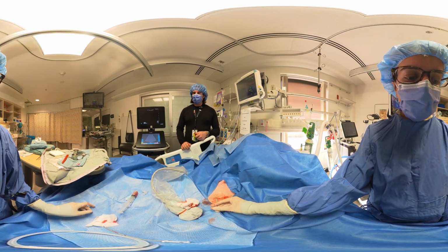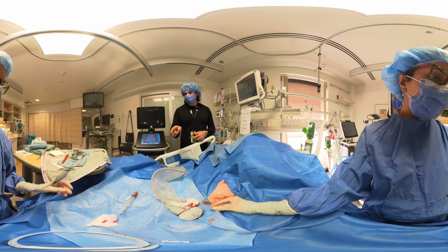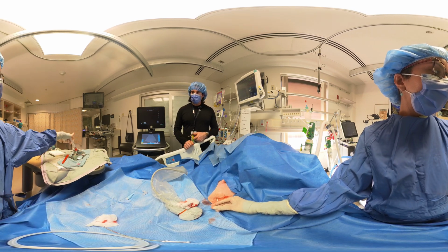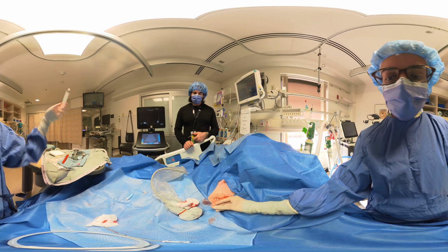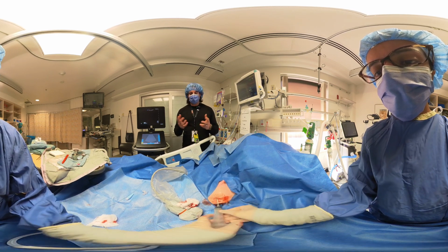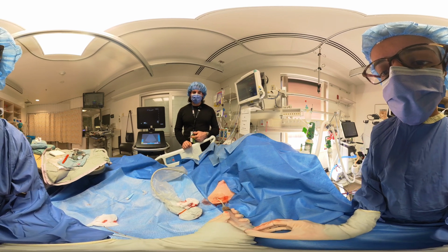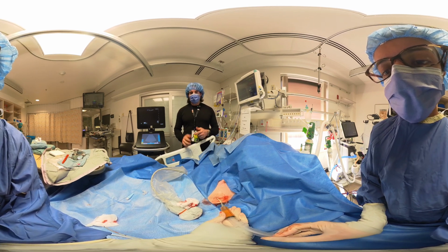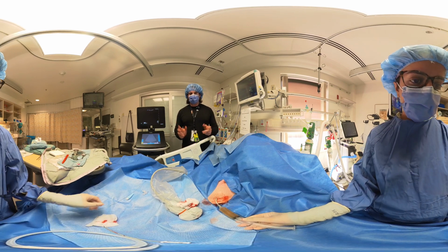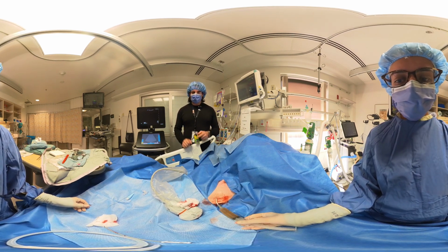Okay, and at this point, we can get a sample. So let's actually, I think we're okay here. If you want to actually maybe get a bigger sample, yeah, with that one. Okay, we can be happy here that we're in the pleural space. If we want to send this for a quick analysis of Light's criteria and also microbiology, perfect, nice serous fluid. Okay, so this is obviously not a sanguineous effusion, but we'll send it for sample.